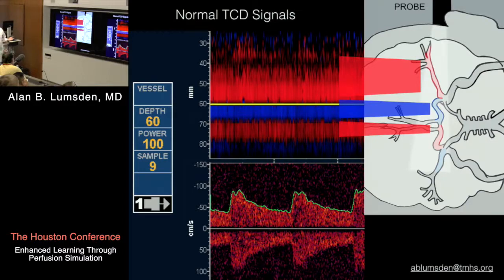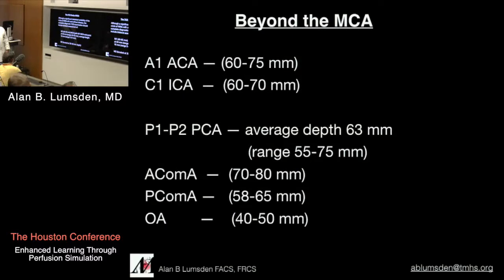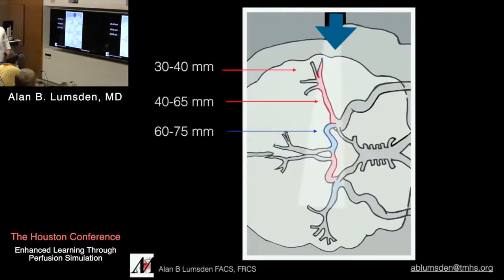And if you have bubbles, you will see this. And you will hear it, yes. So that's kind of how this thing works. Not everybody has a window. 10 to 15% of people don't have a window. That's a problem, actually. But in the people who have a window, I think this is an incredibly valuable tool.